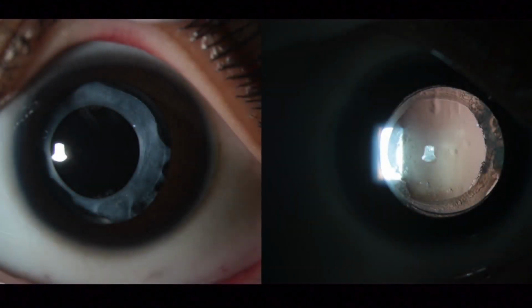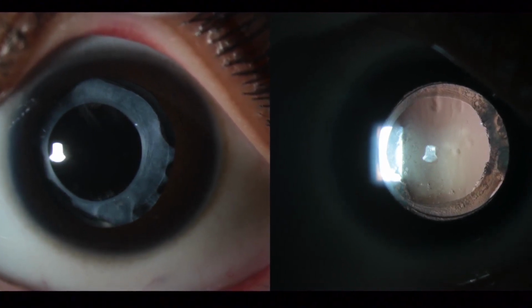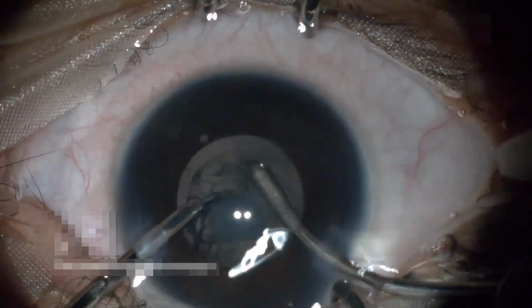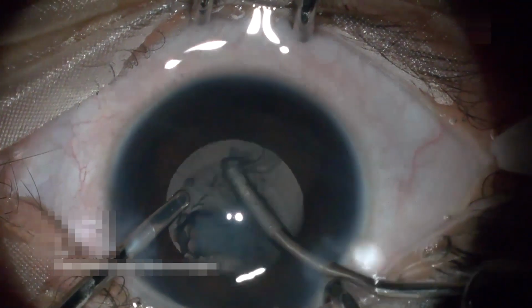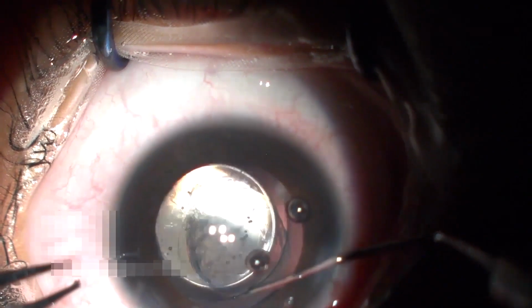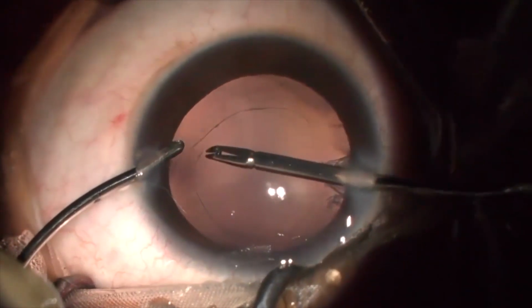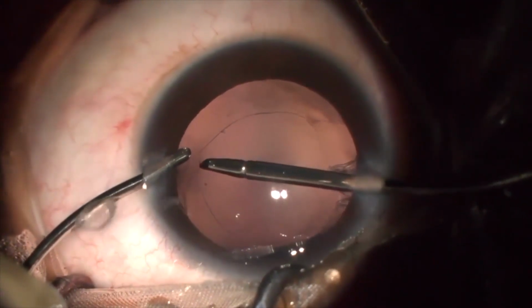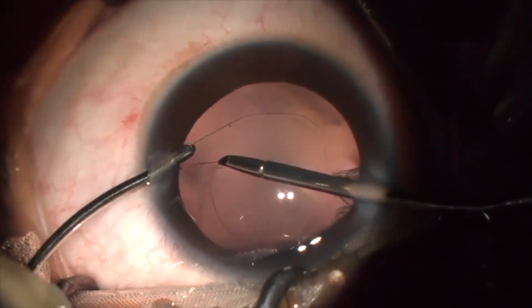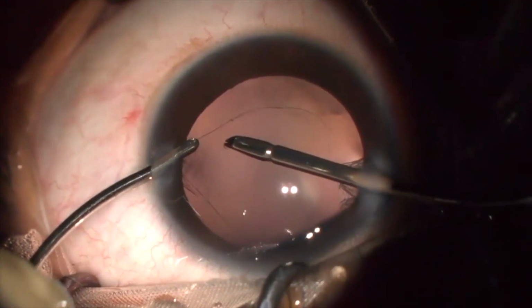A successful outcome in pediatric cataract surgery is determined by an intact, well-centered, continuous curvilinear anterior capsulotomy, the tensile strength of which not only aids in further steps of cataract surgery but also in the bag implantation of the intraocular lens. The thin, elastic anterior capsule poses a challenge in children, especially in infants, which may run away to the equator and cause uncertainty of the stability of the capsular bag.